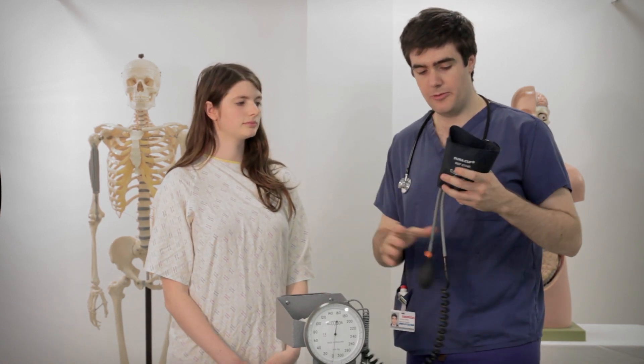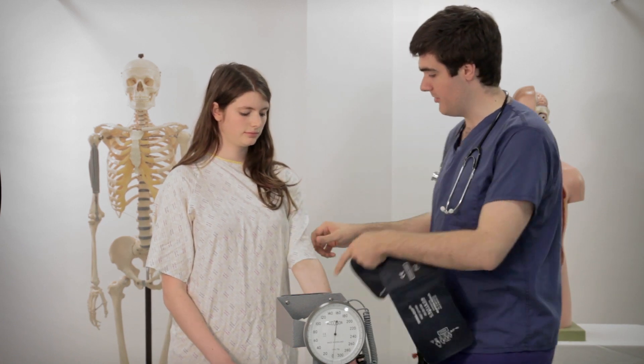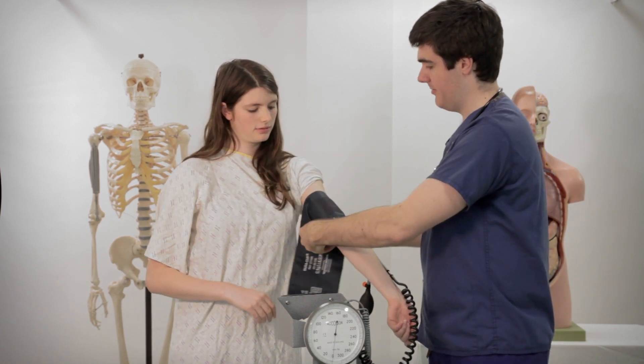Now onto blood pressure. To measure blood pressure we use one of these, which is a blood pressure cuff. That attaches to the arm here. I'm just going to ask you to roll up your sleeve Sophie. You put it on and wrap it around the arm.